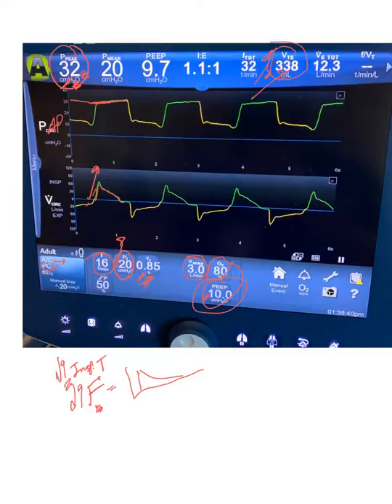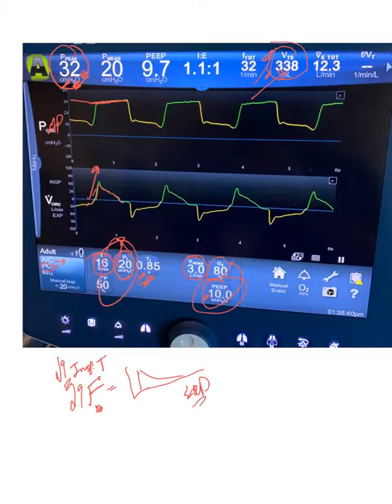Finally, because the inspiratory time is directly set, you can easily calculate the expiratory time. Note that the I:E ratios shown on the ventilator screen are sometimes not fully accurate.